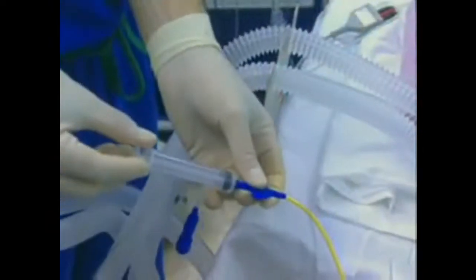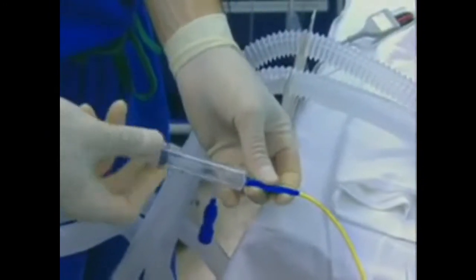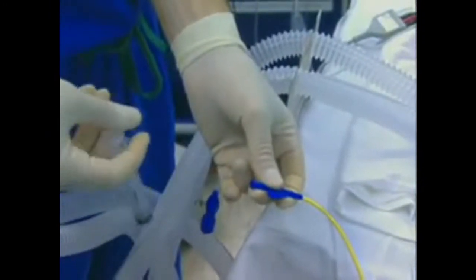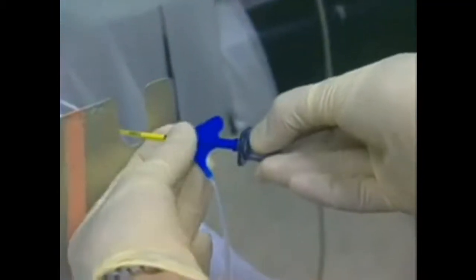Once the loop is removed from the blocker, the lung will deflate both passively and through absorption atelectasis. In addition, deflation can be assisted by direct aspiration with a syringe. The blocker's central lumen can also be used to deliver CPAP with the enclosed adapter.